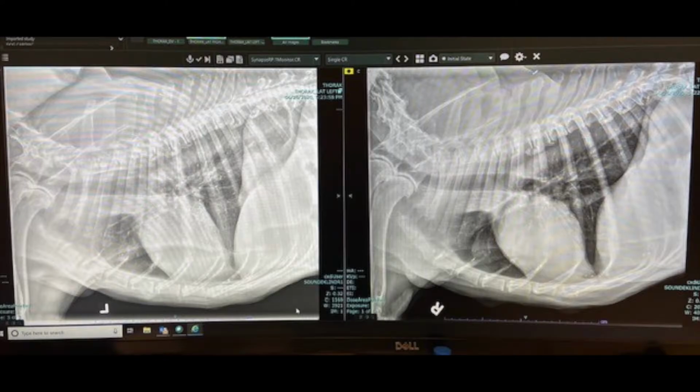Here you can see in the left lateral thorax that is really white and is hard to make out the lung markings. You will need to use the ROI to edit this radiograph to make it diagnostic, like the right lateral thorax shown next to it.